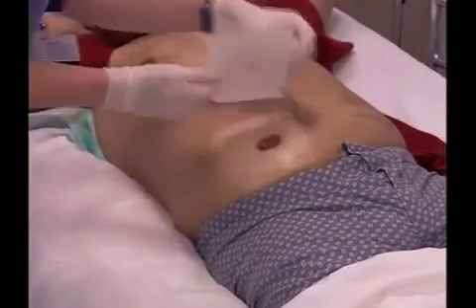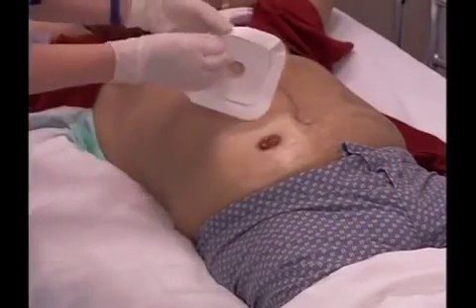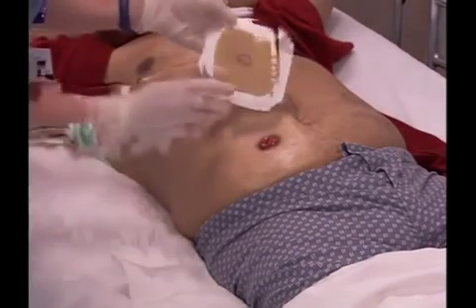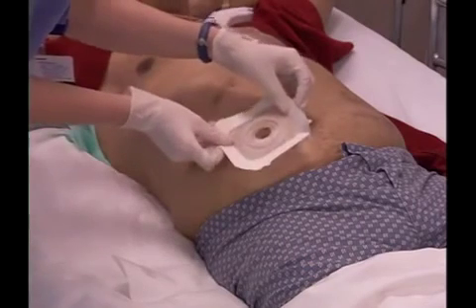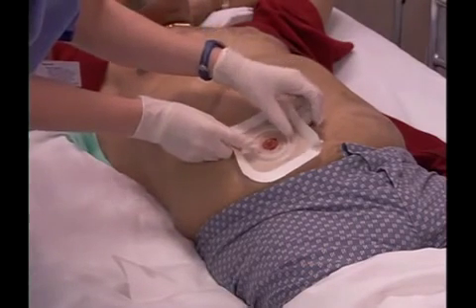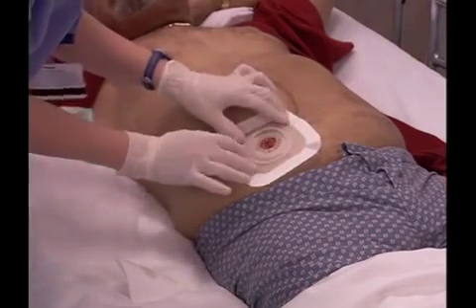Next, make sure the opening of the appliance that fits over the stoma is the correct size. Remove the adhesive backing on the ostomy appliance. Gently center the appliance over the stoma and press around the edges to seal the appliance to the skin.